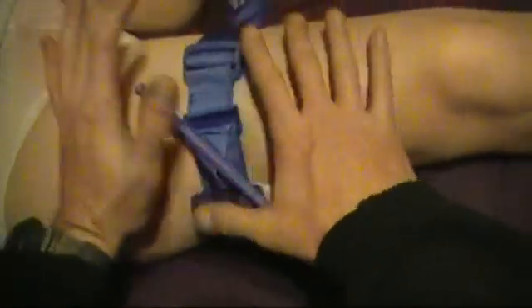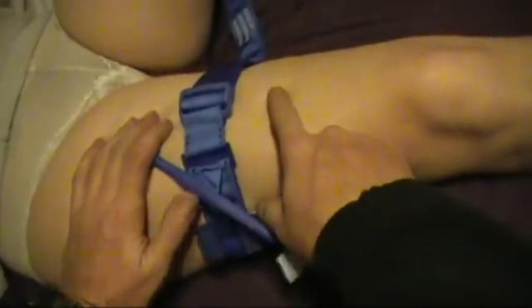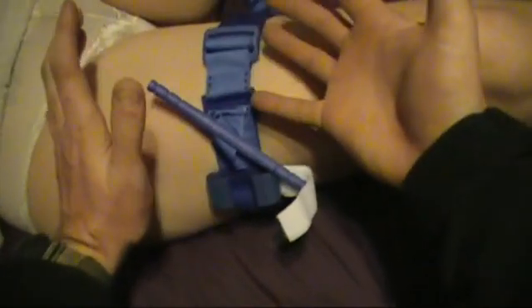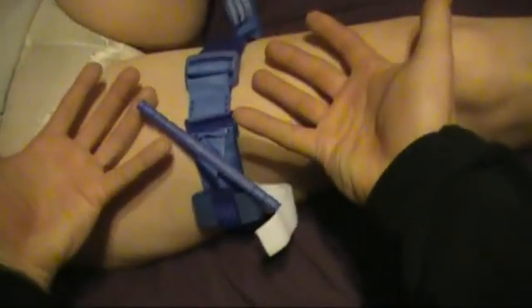Now, I'm not going to crank it down on my patient because it'll hurt, okay? I mean, I'm not kidding, it will hurt. The main thing you want to pay attention to when applying a tourniquet is you do not stop until the bleeding stops, okay? Your patient can scream and yell all they want, but what would they rather be? Dead and quiet or alive and screaming? Tough call, huh?